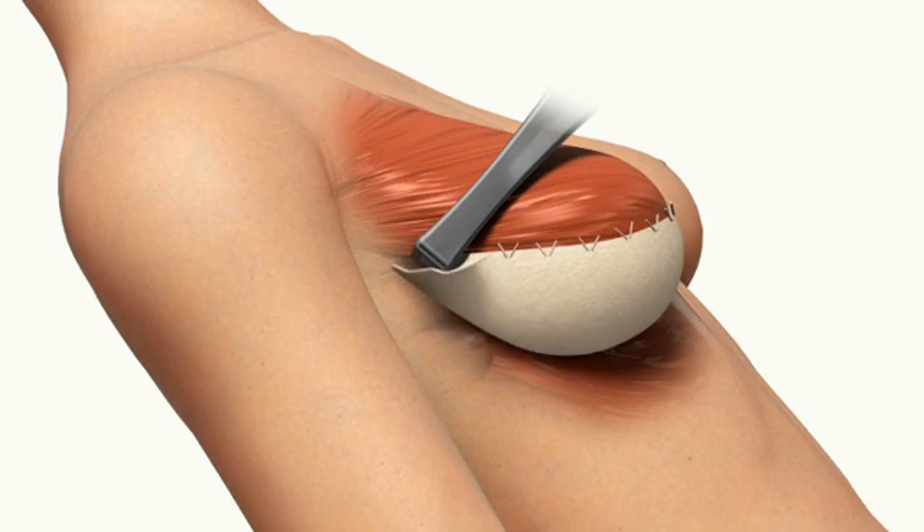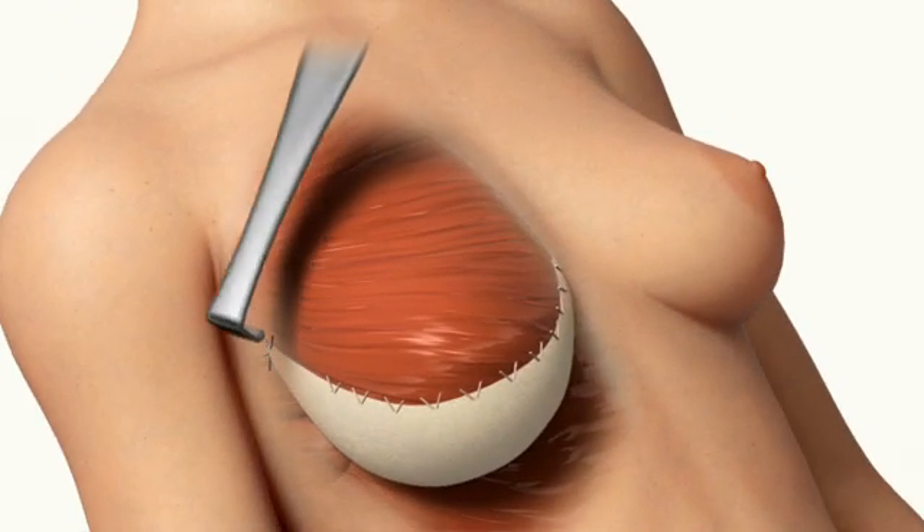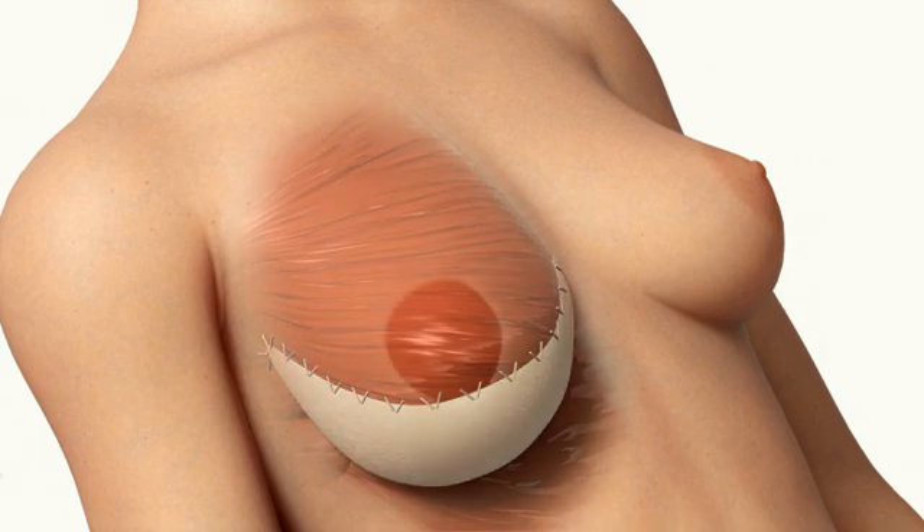Once the pectoralis muscle is pulled over the implant and the Alloderm Tissue Matrix is properly tensioned over the lower pole of the breast for support, the two are sutured together. Scars typically fade over time.